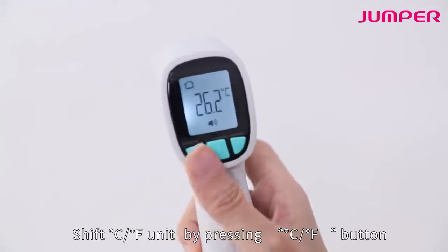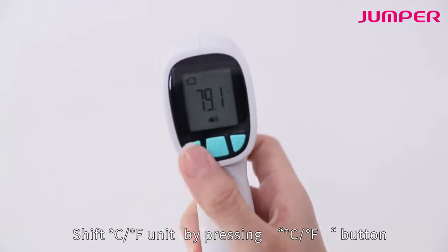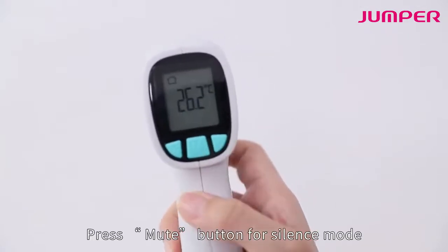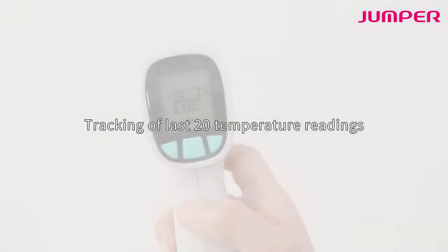Shift between Celsius and Fahrenheit units by pressing the CF button. Press the mute button for silence mode. The thermometer tracks the latest 20 temperature readings.